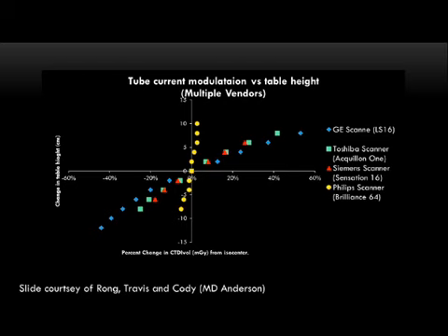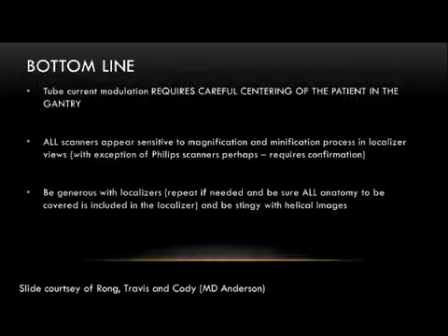I think there's lots of opportunity to make sure that we're working right here where everything's nice and tight, to make sure we're doing that when we're scanning the patients. So to use tube current modulation, it is very, very important that the patient be centered.